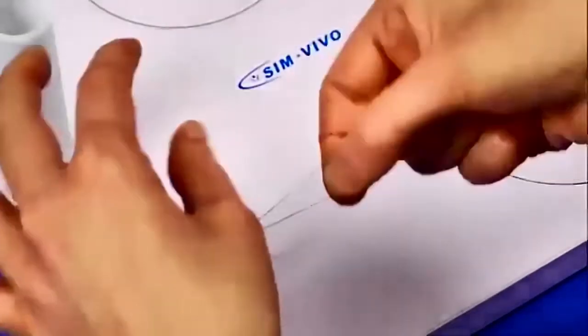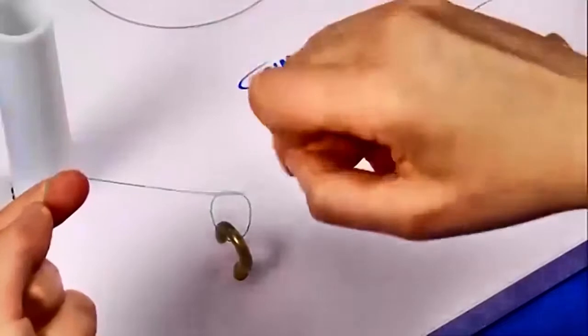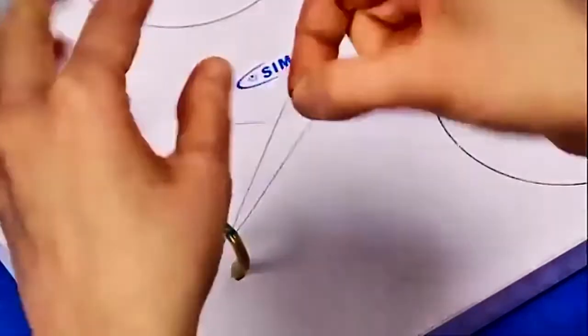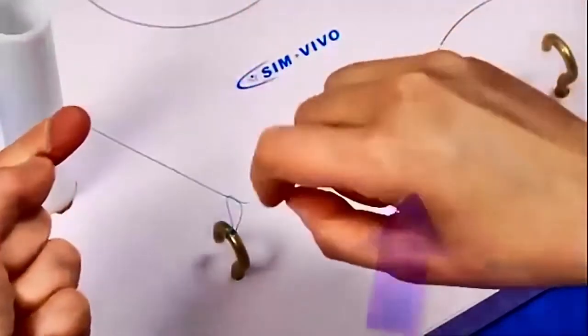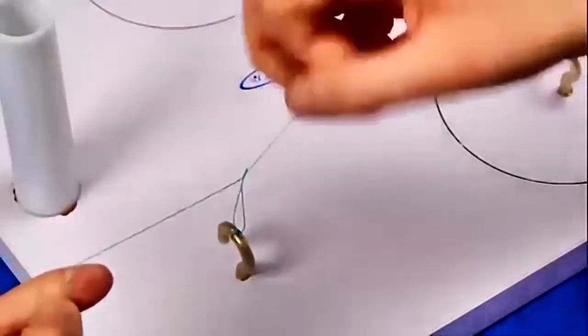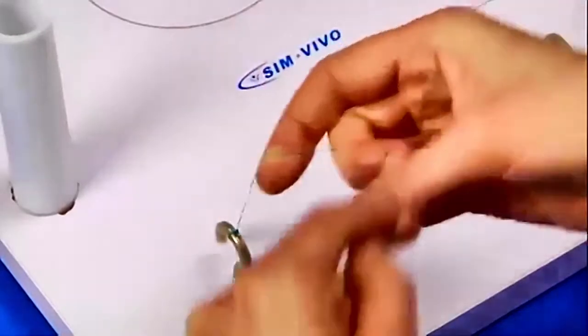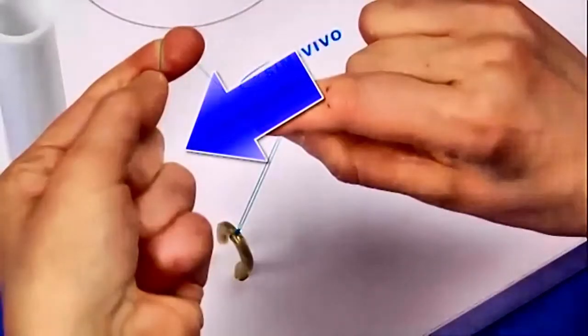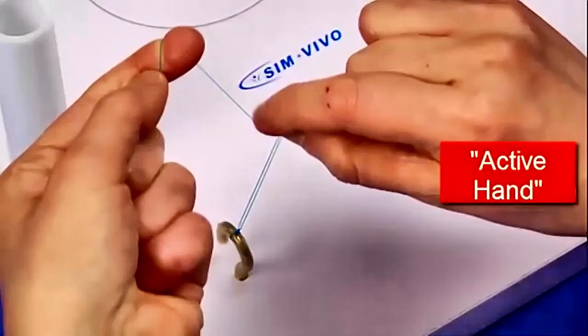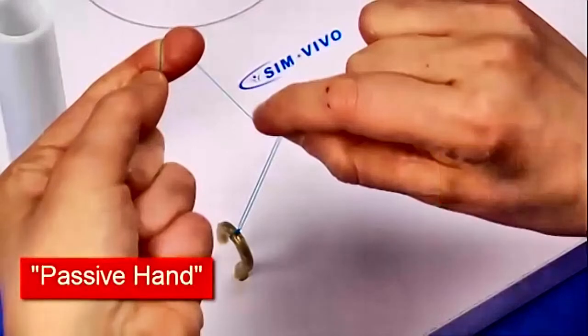In two-handed knot tying, the first question that must be asked is, which hand are you going to use to do the work of knot tying? In general, as we tie knots, one hand is responsible for a majority of the manipulation of the suture, and the other hand just passively holds the end of the suture, as in the one-handed knot, or just releases and grabs the suture, as in the two-handed knot. Let's call the hand making all of the posts and loops the active hand, and the hand primarily doing the holding, the passive hand.